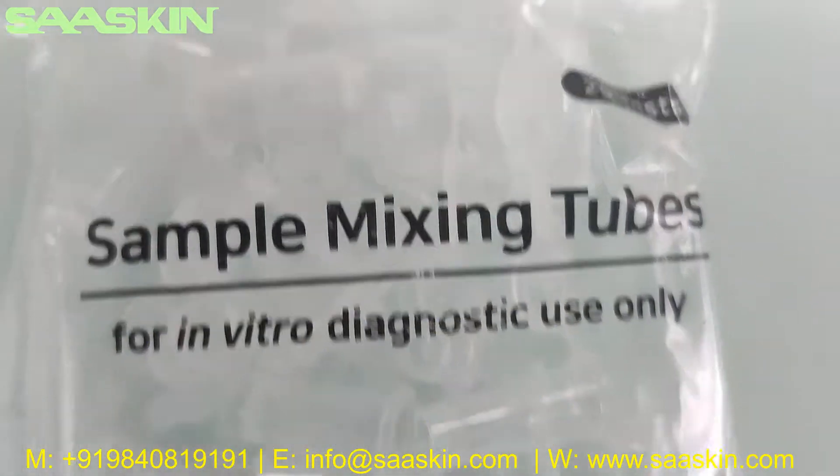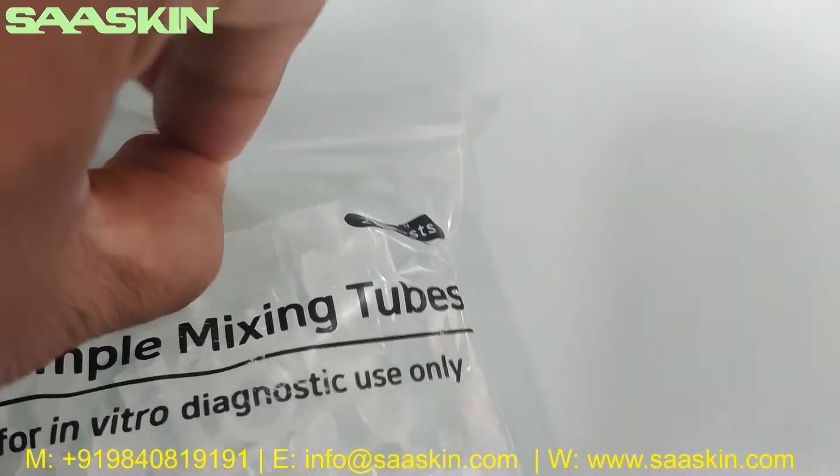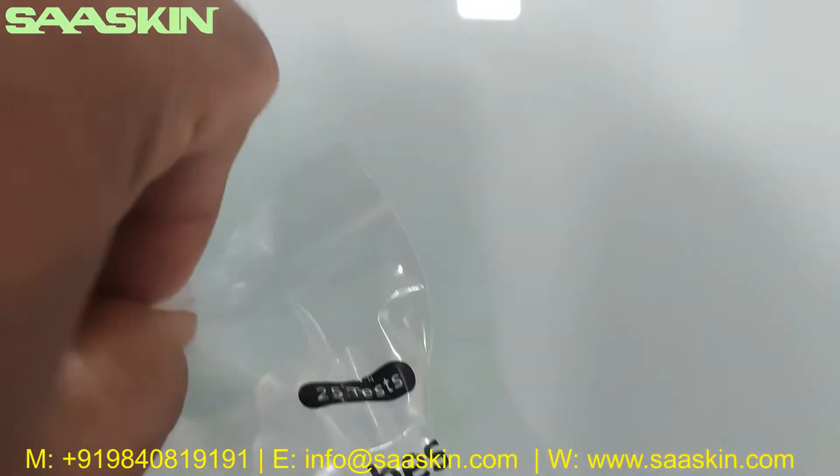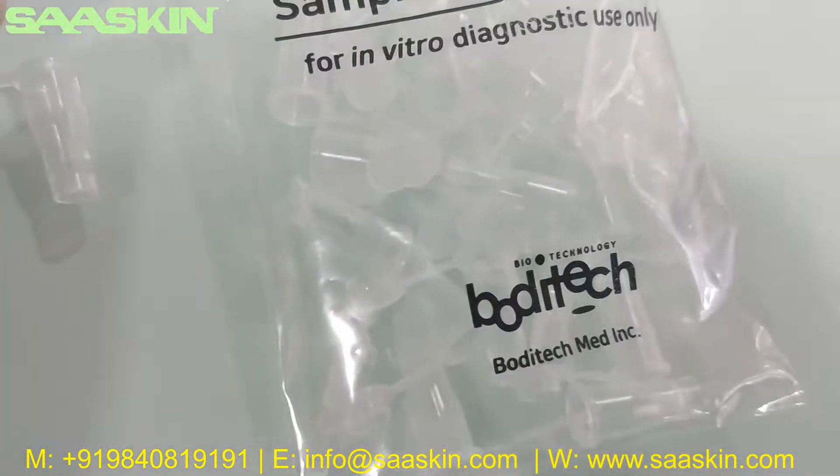Further inside the box, there is a 25 pack of sample mixing tubes. I'll try to pull one out of the pack to show you. You can see the sample mixing tubes — this is how they look.